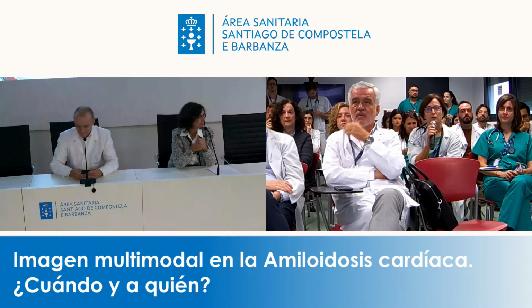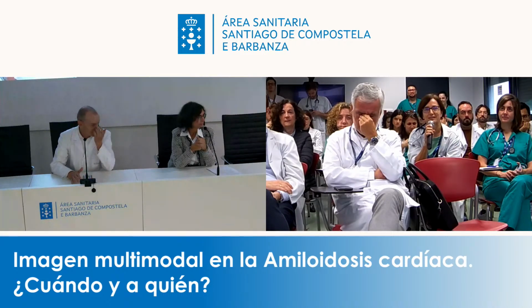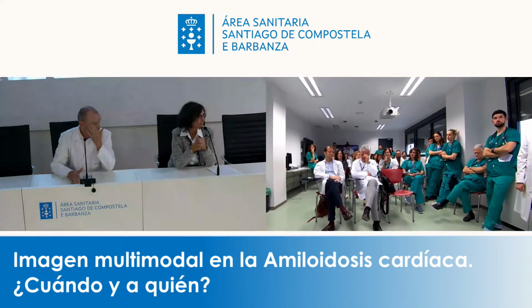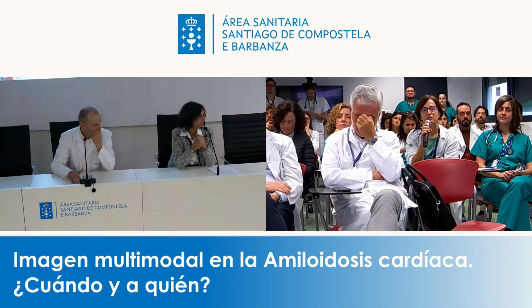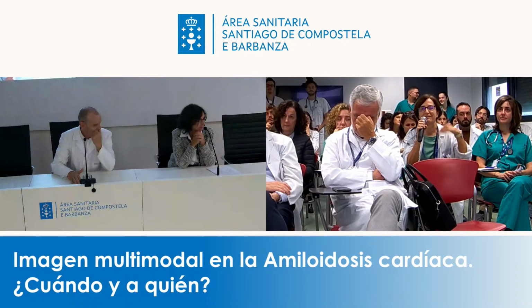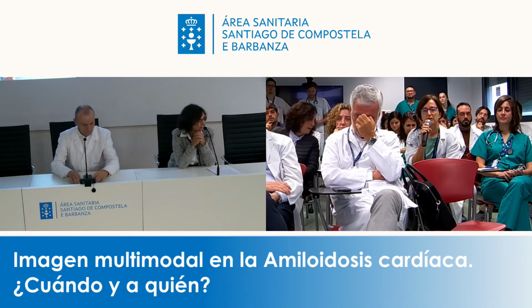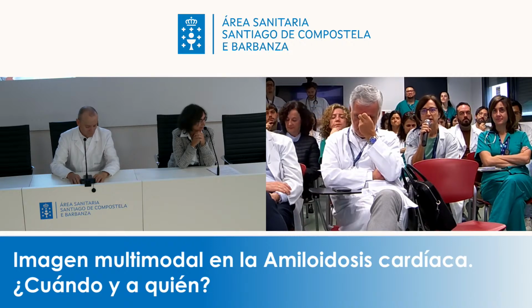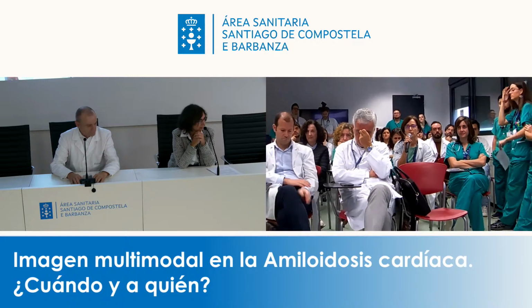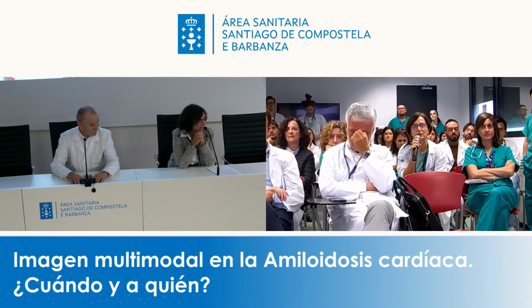Perfecto. Primero de todo, felicitar a la doctora Timoteo por la charla, ha sido espectacular. Yo que me dedico a la imagen, pues ha sido muy integradora. Y también como clínica, siguiendo tu estela, José Ramón, cuando decías que en algún momento hay que decidir qué técnicas hacemos. Inicialmente, muchas veces tenemos una sospecha diagnóstica de amiloidosis, hacemos el eco y la gammagrafía nos muestra un Perugini 3. Aquí paramos, ¿no? No hay que hacer resonancia a todos los pacientes, lo que decíamos antes.